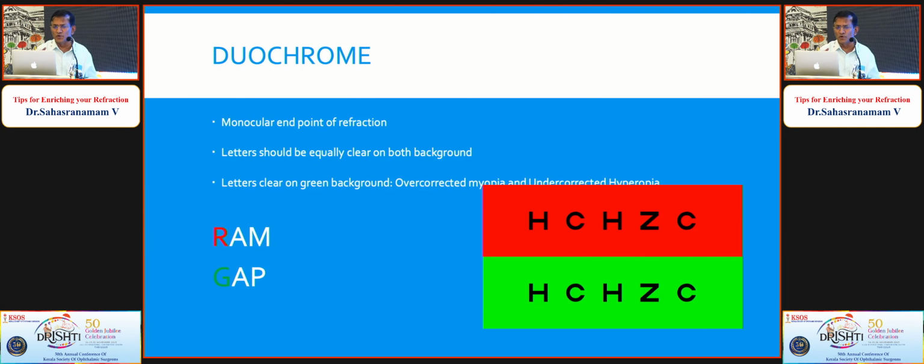Even the duochrome test will help you probably. I think you can just read it up because the time is over. Normally, for the final spherical correction of 0.25, you can make use of this duochrome test. How you evaluate it, if we get time, I'll tell you later.